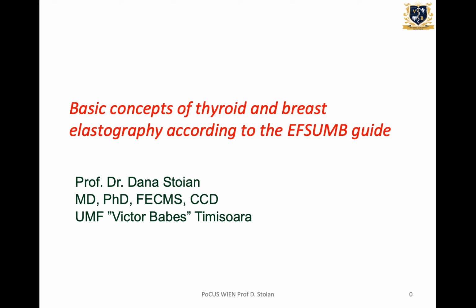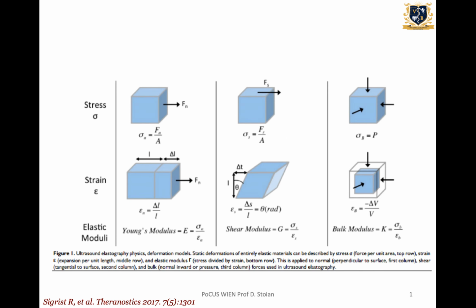Moving forward with our next presentation regarding the basic concepts of thyroid and breast elastography according to the current European and world guidelines. So we have in front of us two major families of elastography, and the tissues behave differently according to their elasticity when exposed to stress.